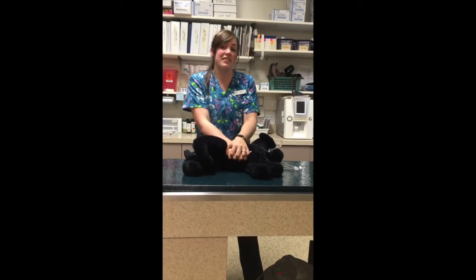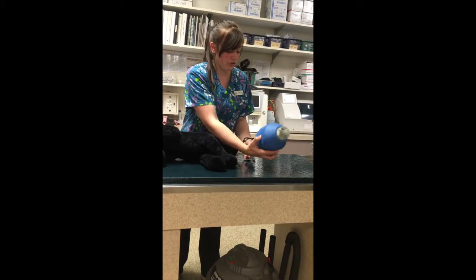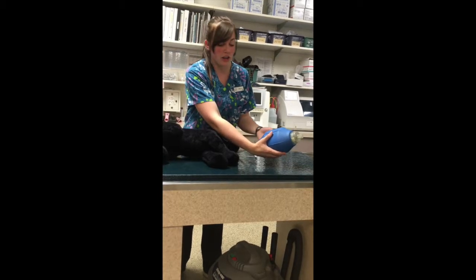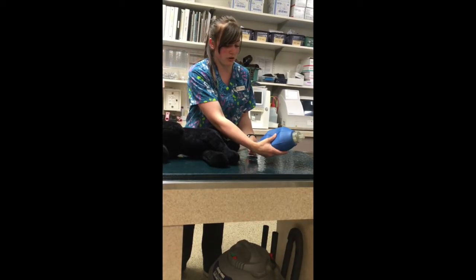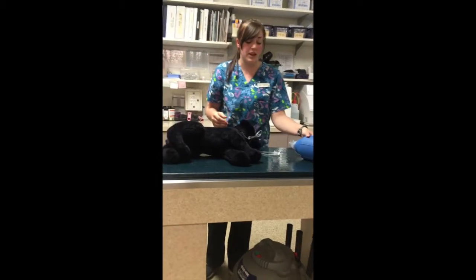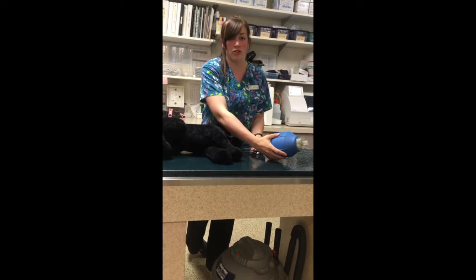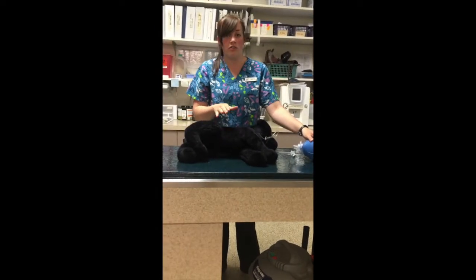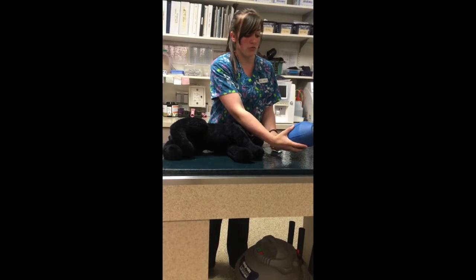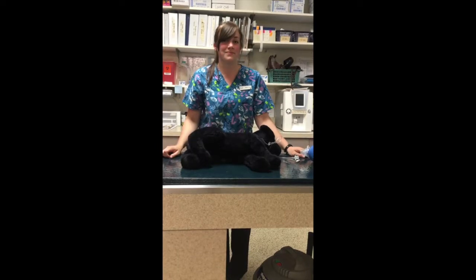And then you're going to have an assistant who will be giving breaths with the ambi bag. Make sure the oxygen that you're giving your patient is 100% oxygen, given with an ambi bag, at a rate of 10 breaths per minute. When you're giving breaths, you want to apply enough pressure that the chest rises and looks full. Once you feel a little bit of pressure, you want to stop and release. You don't want to overinflate the lungs and cause more damage.